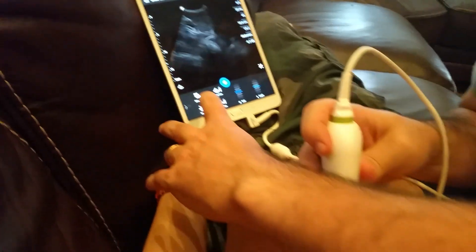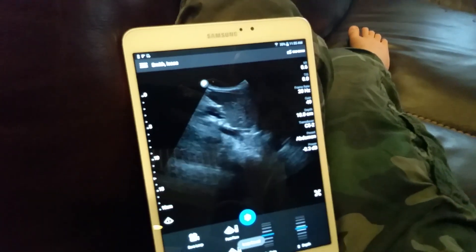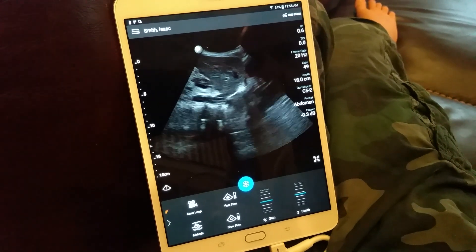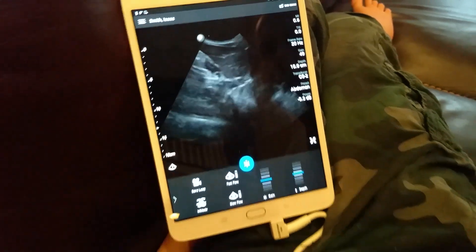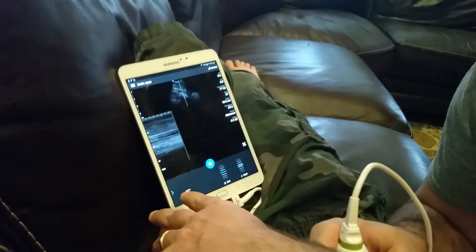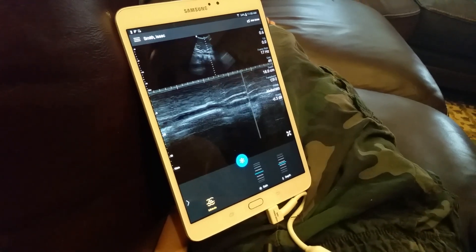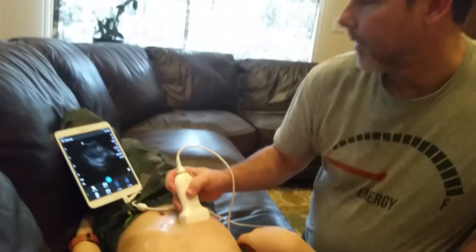To get a better view, save a picture and have your patient take a deep breath and bear down. There it is — nice and pulsatile. You want to get it right where it attaches to the right atrium. Have the patient exhale, and you can see he's a little bit on the dry side. Using M-mode measurement, you can see collapse of the IVC as he takes breaths.